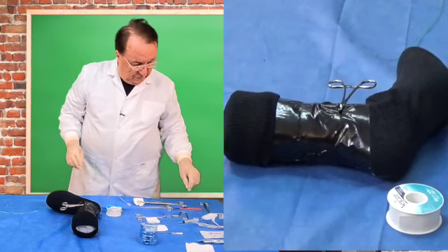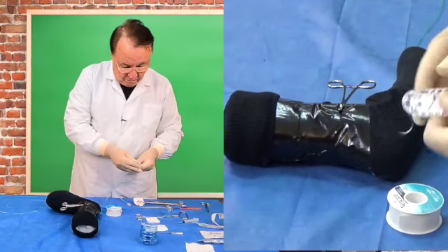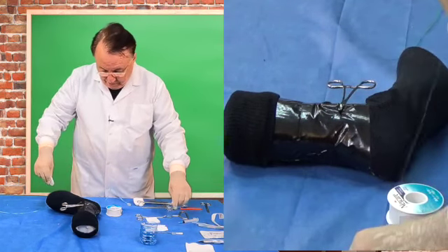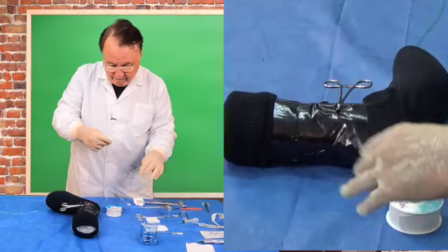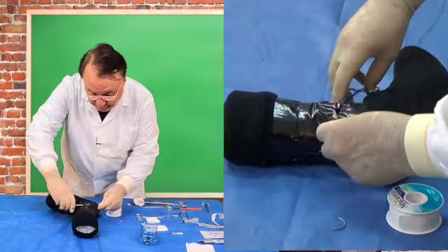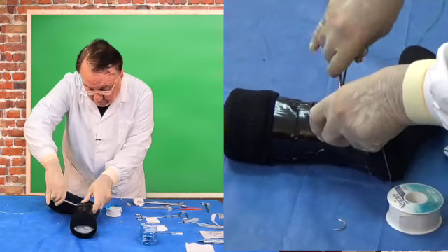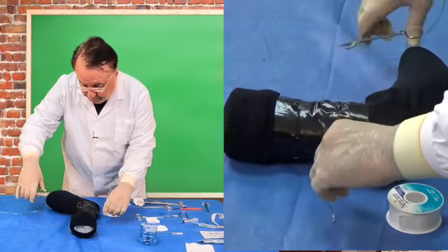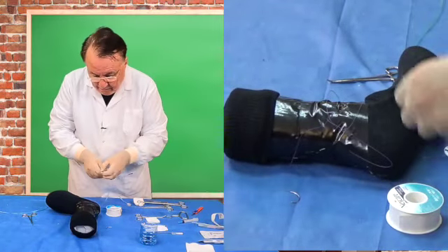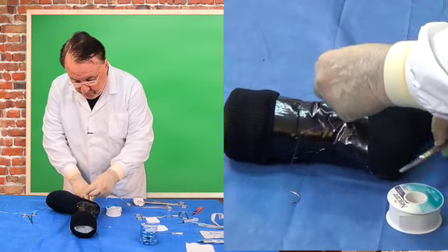Now, you want to control that vein, just like you would any other vessel. So, I do that with a suture. I loop the suture, grasp it with the artery forceps, and pull it under the vein. I need 2 sutures, so I'm going to cut this one and make it into 2.